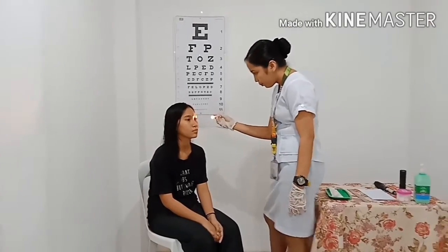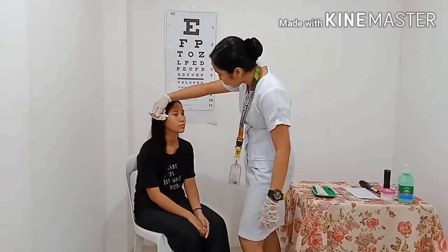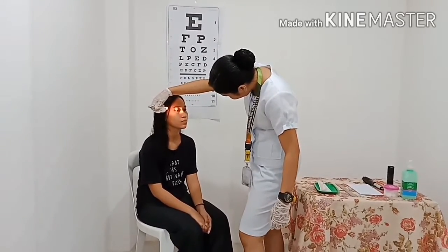Because if there is any shadow or darkness, it may indicate glaucoma. So, ma'am, will you please look straight forward? Then the other side. So, the anterior chamber transparency and depth of the client's eyes is normal, and there is no presence of shadow reflected by the pen light.